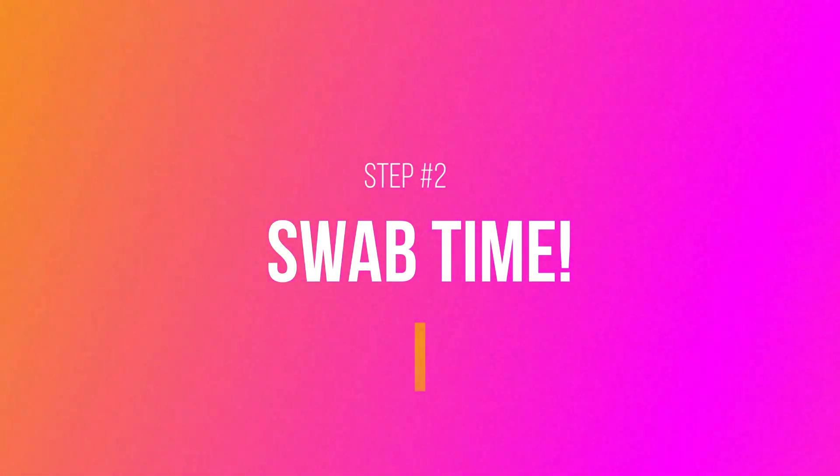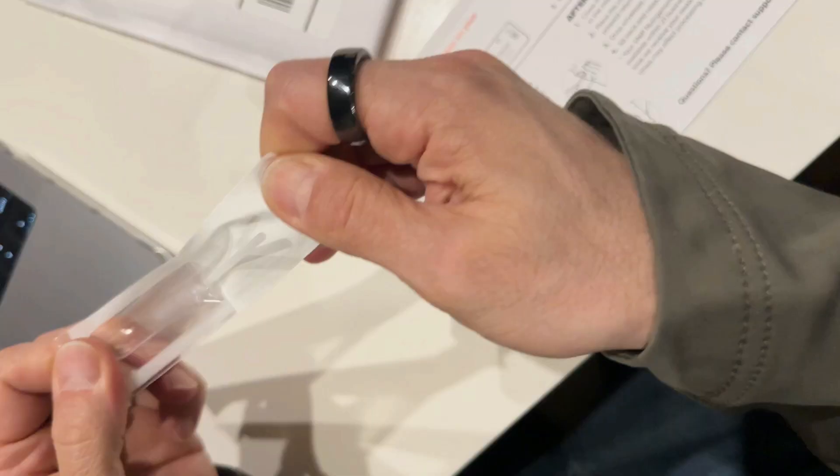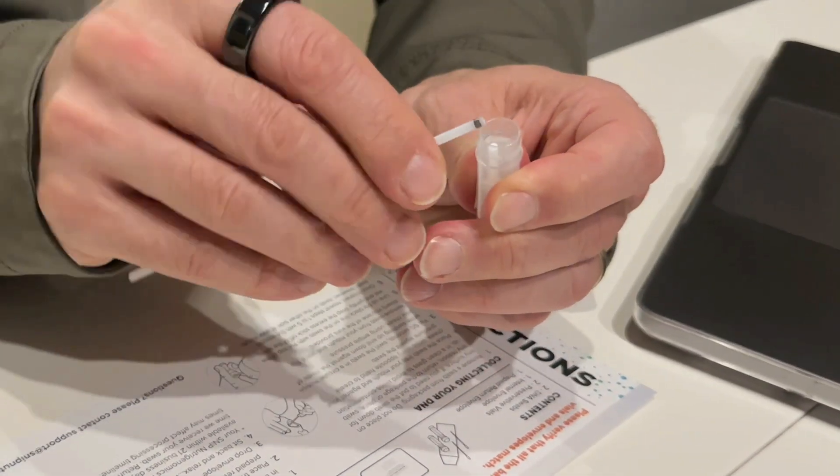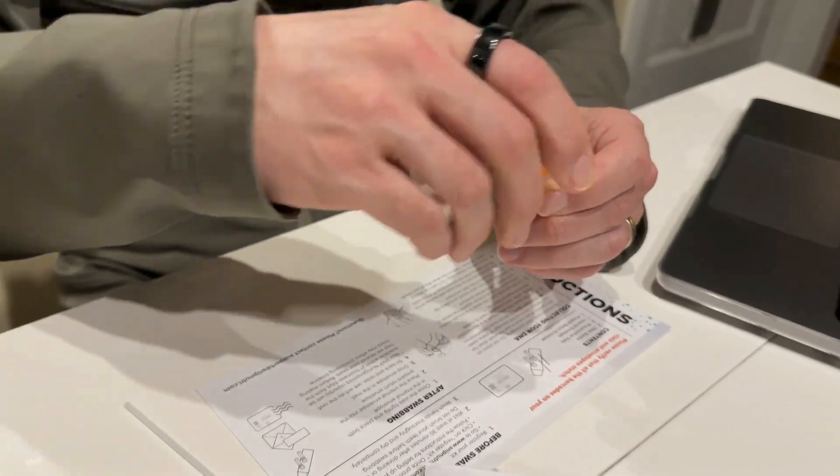Next, it's swab time. Place a swab against your cheek while using the opposite hand to create pressure. Swirl for 60 seconds, then insert the swab into the vial, snap off the excess, and close tightly. Then repeat with a fresh swab on the other side of your mouth.